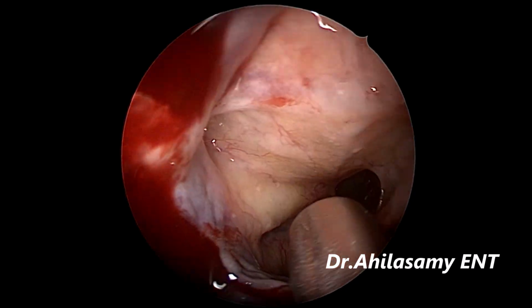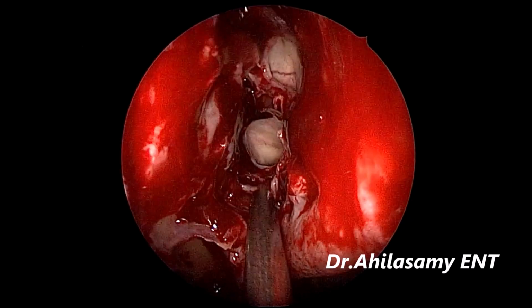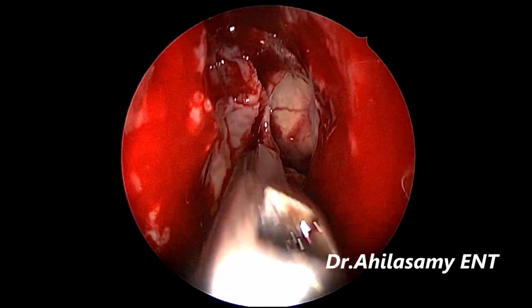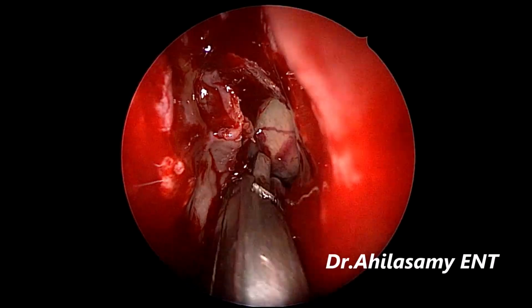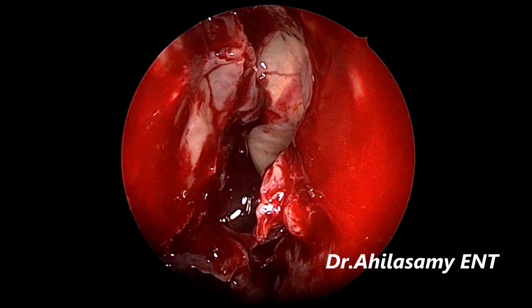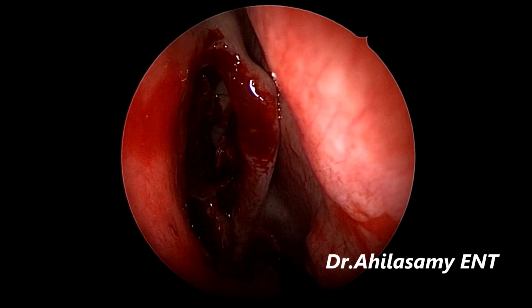This is skull base, skull base, skull base. Again using the through-cut to remove all the ethmoidal cells.